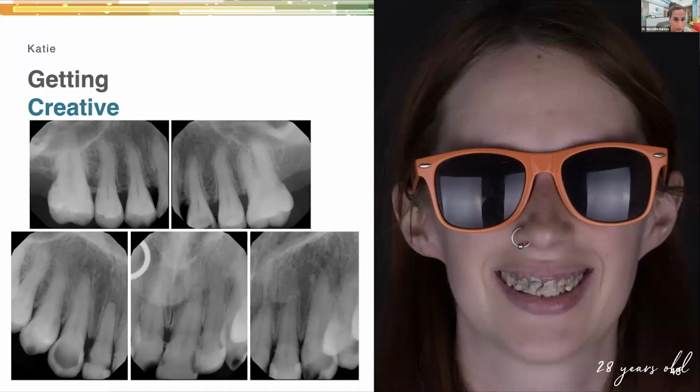But when you look at the x-rays that we have of Katie, right? And I posted some of those PAs in there. When you actually look radiographically, Katie actually has restorable teeth. And so Katie needs, of course, a lot of dentistry, and it can be a lot of expensive dentistry, right? And so it's really, again, so helpful to be able to print and puck mill and have really economical ways of helping someone like Katie, who's 28 years old, and to edentulate her would just be such a horrible thing to do. Like that would weigh so heavy on my soul.